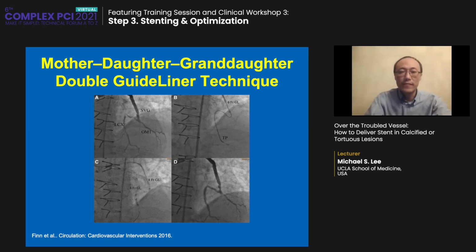Here is a saphenous vein graft that is anastomosed to the obtuse marginal artery. There's a focal lesion at the bifurcation as well as in the distal circumflex. This operator initially advanced a 6 French guide liner to facilitate the traversing of the lesion with the wire. Once the wire was across the lesion, they advanced a 6 French guide liner and also advanced an 8 French guide liner. And here's the final angiographic result, which shows the lesion in the distal circumflex as well as the bifurcation of the circumflex obtuse marginal have been stented.